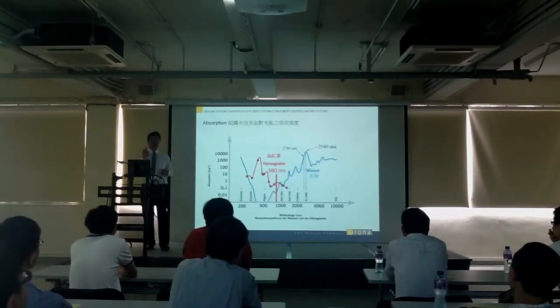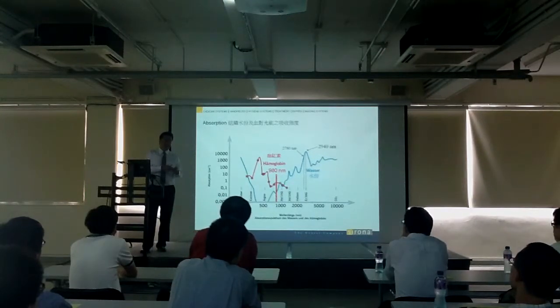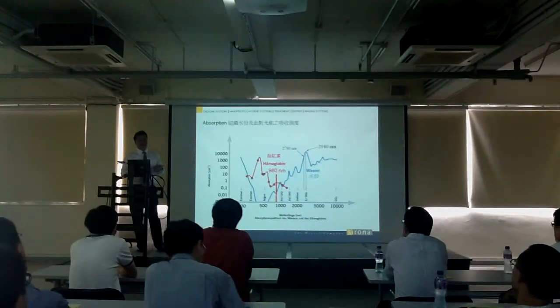It means if you stick a diode laser into a cup of water, you can sit there and step on the pedal for a year. Nothing happens. Nothing. So a diode laser does not work in a very wet environment, but it works well in an environment where there are a lot of dark pigments.